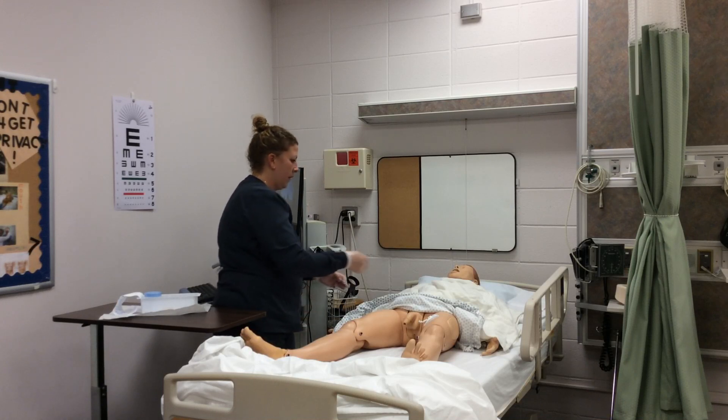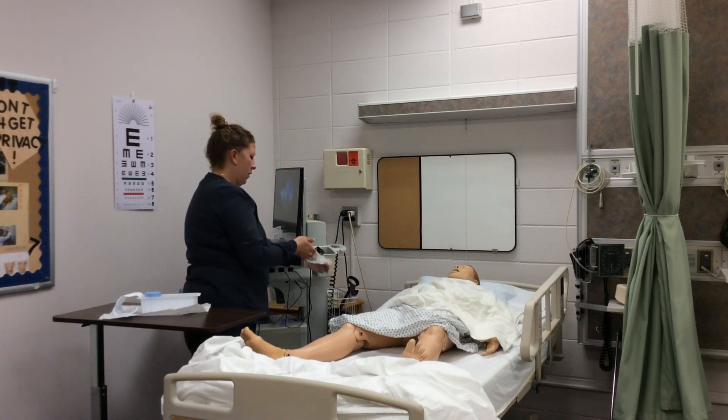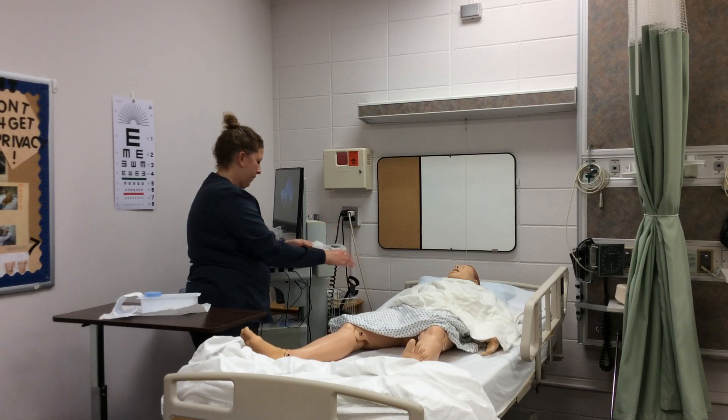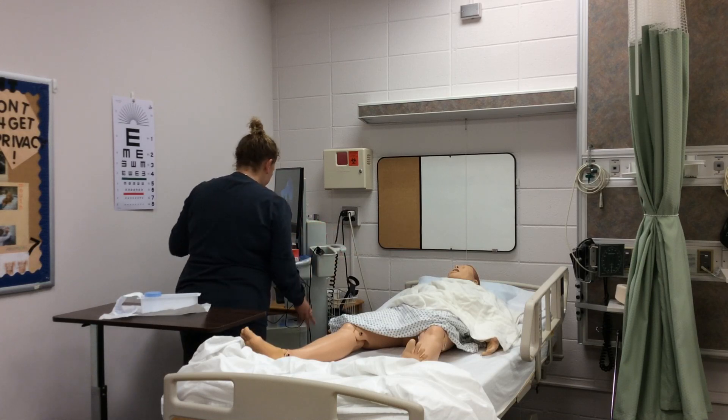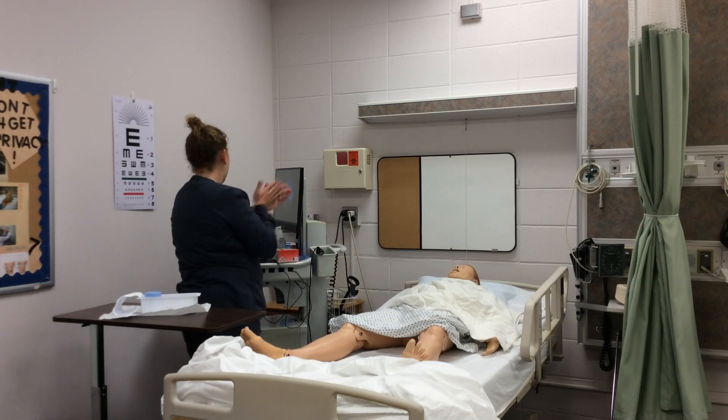She removes her soiled sterile gloves and performs hand hygiene, then puts on new non-sterile gloves.